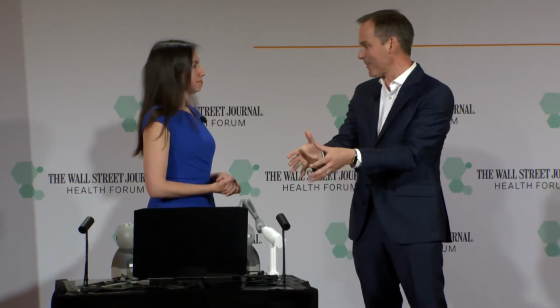There's been a number of studies done across the last 5 or 6 years on looking at different types of virtual reality with mixed results, but generally a positive one. I think the key thing is most of those have not had the haptics. And removing touch from a surgical rehearsal such as that, you imagine trying to ream that acetabula without being able to feel when you got there. Suddenly you're relying fully on sight. It's kind of a game then rather than an actual simulation.